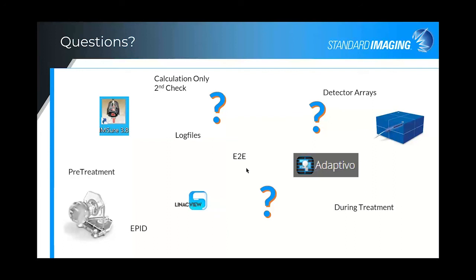And that gives you a good comparison, for example, using the W2 with the SDVP in the lung material insert. That gives you a great comparison between a Monte Carlo algorithm and a convolution superposition. And so you can tease out the deviations using a combination of these solutions.